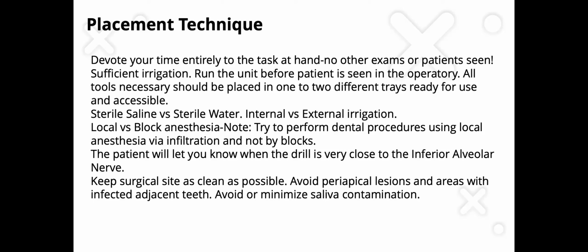Run the unit before the patient is seen in the operatory. The last thing you want to find out, right when you're placing your implant, is that you're not getting any irrigation because something is stuck in the system. All tools necessary should be placed in one or two different trays, ready for use and accessible.